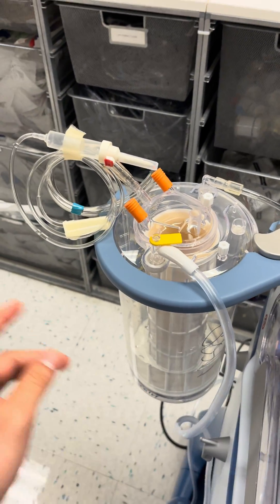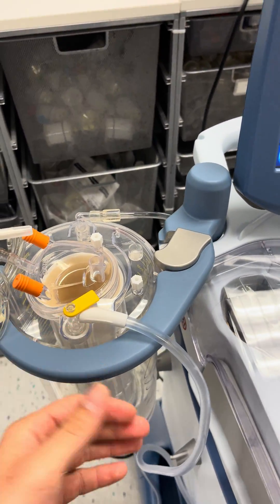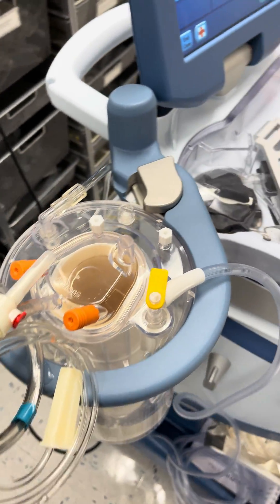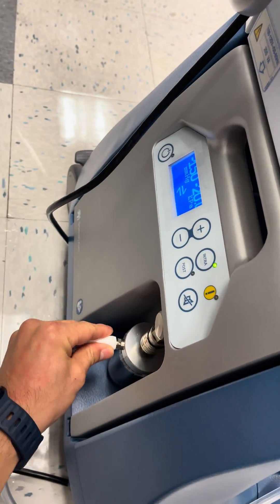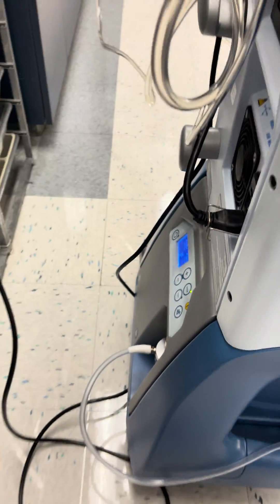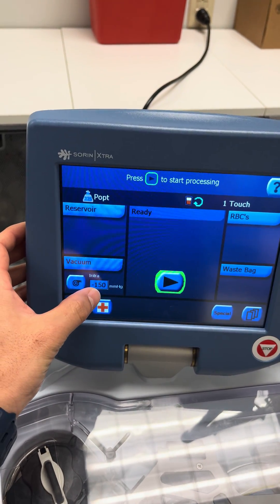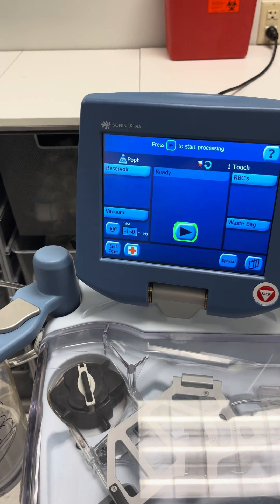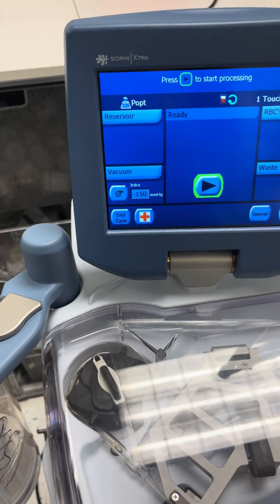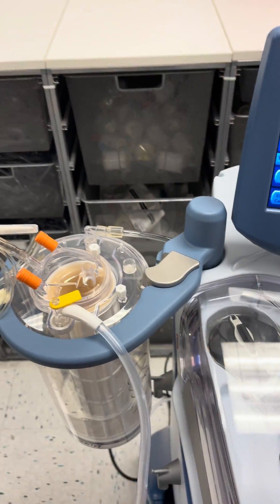The vacuum can be attached to something like a Neptune, which is a really strong vacuum source commonly seen in the OR, but the Cell Saver actually has its own suction as well. This is the vacuum port — you can control the negative pressure right here. Typically you want to go no higher than about 150 to 200, and that's what provides your vacuum power.